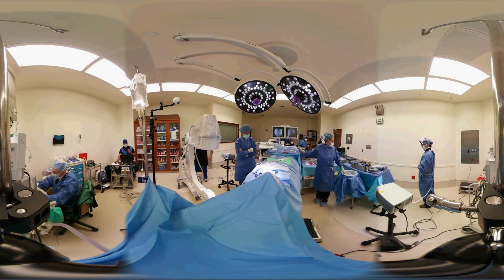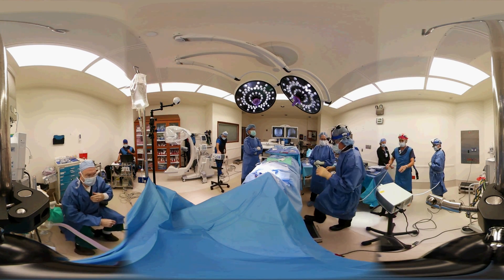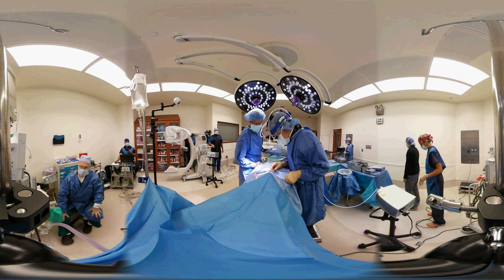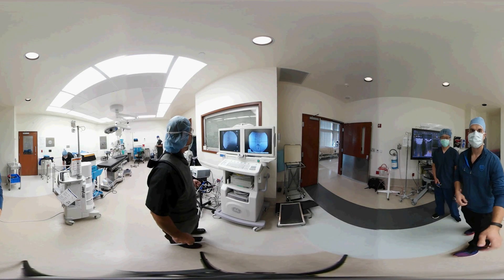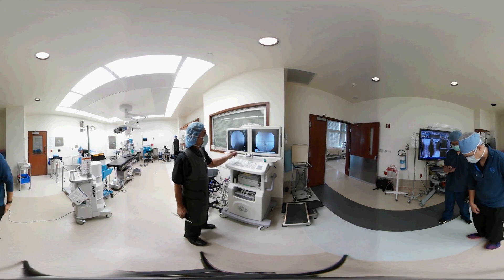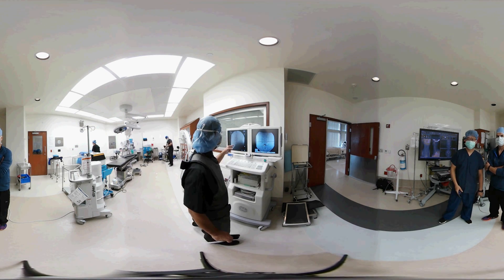Now we will close the incision. During closure we do not use any stitches on the outside of the skin — we use a plastic surgery closure in which we put paper tapes or sometimes surface glue, much like super glue, on the skin so that postoperatively the patient doesn't have to do anything special with the wound. The surgery went just as planned. The patient had a disc replacement at the C6-7 level using the Movi-C device. This is the side view and the front view of the neck. What we look for is the alignment of the spine — the alignment within the disc space looks just perfect on both views.